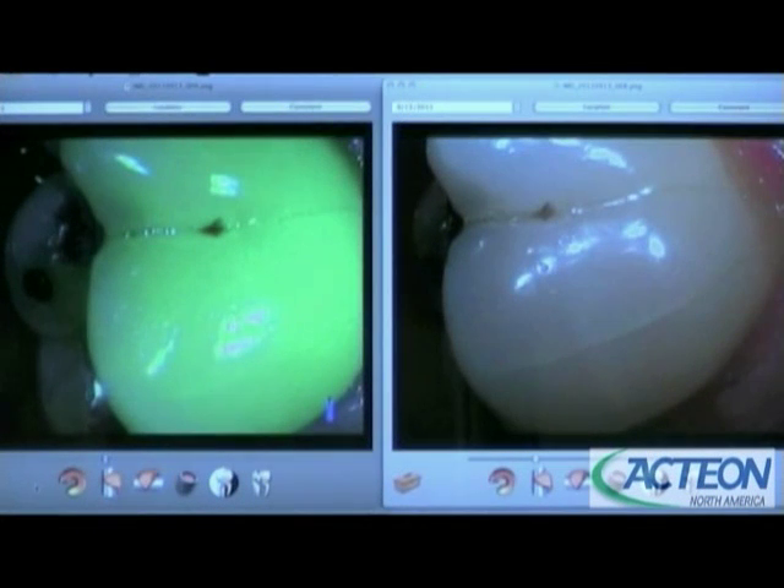Now we have that same tooth in a split screen. On the right is just that shot in the daylight mode, using the SoPro Life mode with the black cap. The one on the left is going to be in our diagnostic mode — where, again, you're going to be able to see the affected dentin right there.